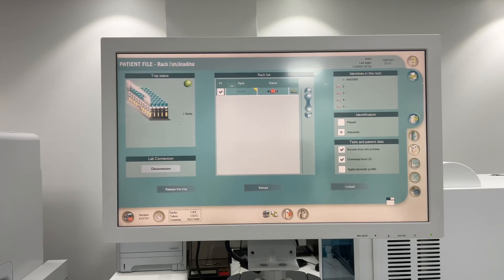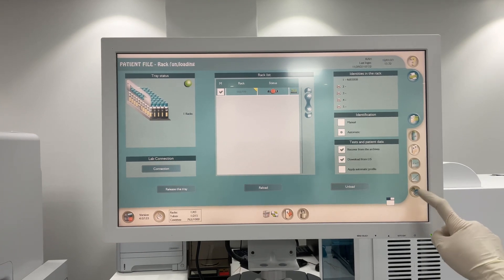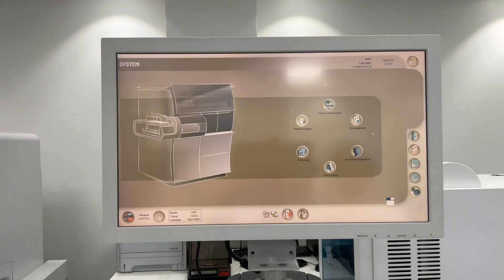On this screen, patient file rack loading and unloading - you will find the connection. Disconnect first. Then you can go here on the right, down to settings. Click on the settings here, then maintenance.